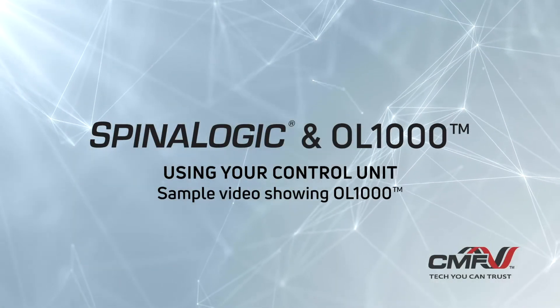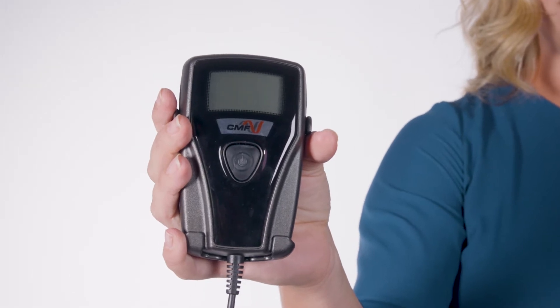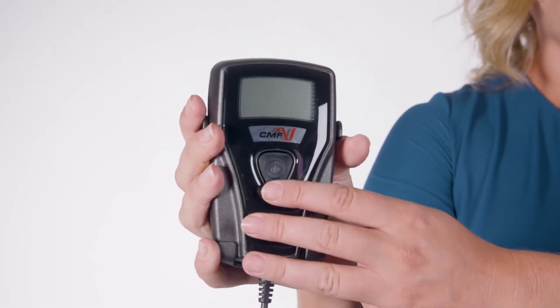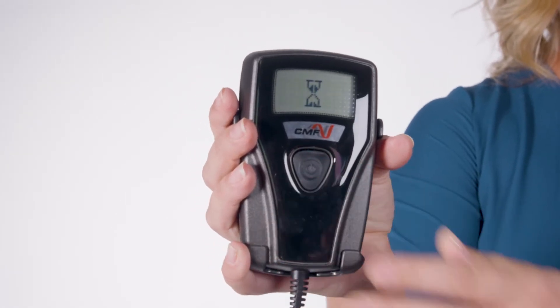Using your control unit. This is your control unit. This control unit consists of an LCD display and a button. To begin your treatment, push the button next to the LCD screen, holding it down until it beeps.